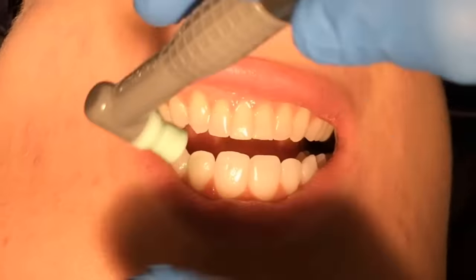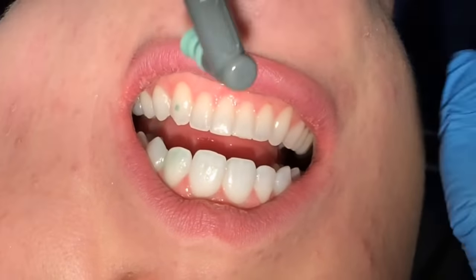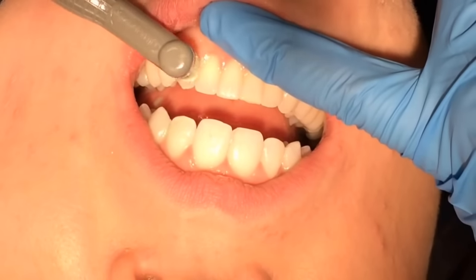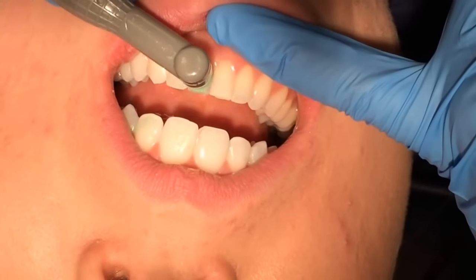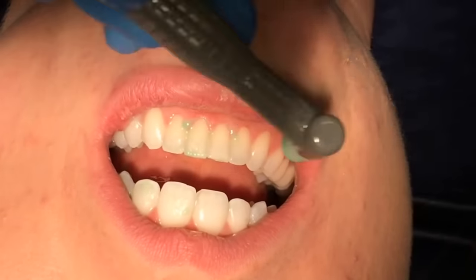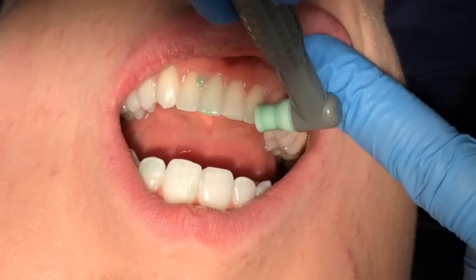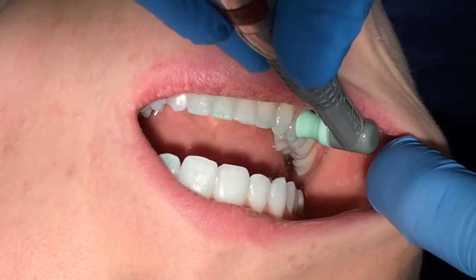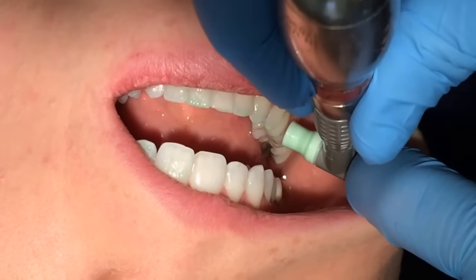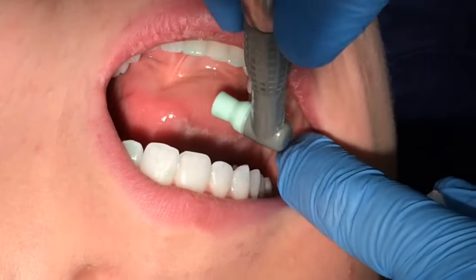Candy here is doing just great — she doesn't have a lot of spit going on, so thanks Candy. I always make sure I have a fulcrum so I don't fly off the tooth or fling prophy paste everywhere. When I first started as an assistant, I was messy Jesse — I had prophy paste all over my clothes, all over the patient, all over the operatory, and all over everything.